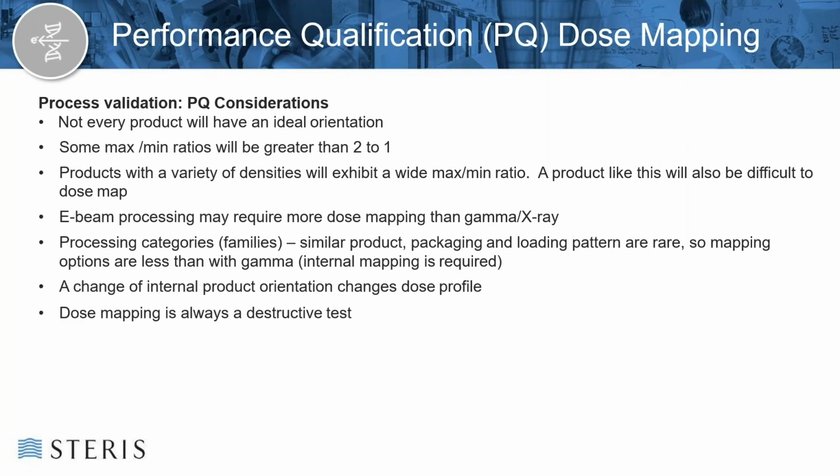Dose mapping is a destructive test, but we'll conduct that dose mapping on dunnage units. They need to be physically representative of the routine product. And those dunnage units could serve as dunnage filler in routine processing.